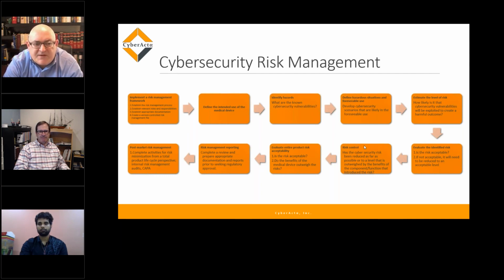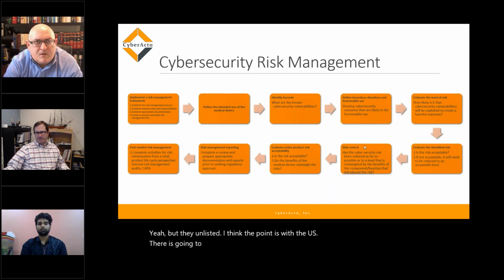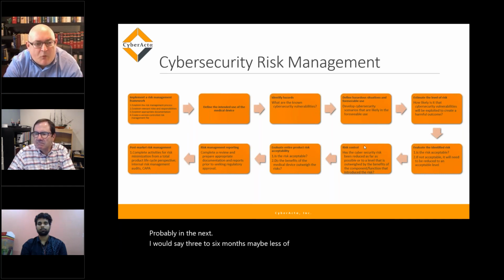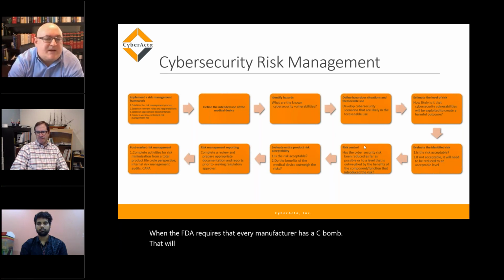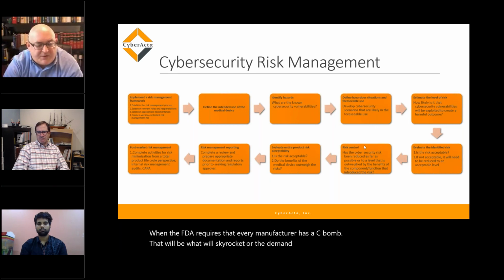Yeah, but listen, I think the part with the US is that there is going to be, probably in the next, I would say, 3 to 6 months, maybe less than that. I know they want to do it before EU MDR goes live. When the FDA requires that every manufacturer has a CBOM, that will be what will skyrocket the demand for medical device cybersecurity practices and implementation.